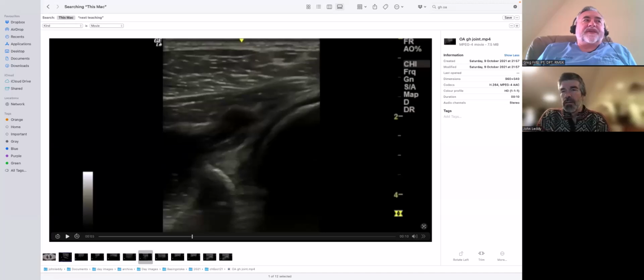Now you had said until you go around the corner. I'm assuming until you leave the anterior view and you start looking at the posterior shoulder. Well, posterior, but for a lot of arthritis, it's posterior inferior, and actually sometimes you only see it with the inferior view, which is why it's now part of my standard exam. I always look into the axilla when I scan a shoulder.